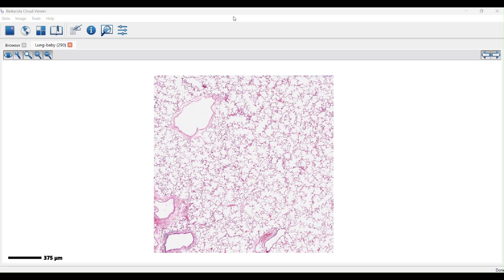For this video, I'm using the BioLucida software. It's good for practicing the histology lab. It contains so many slides for educational purposes.